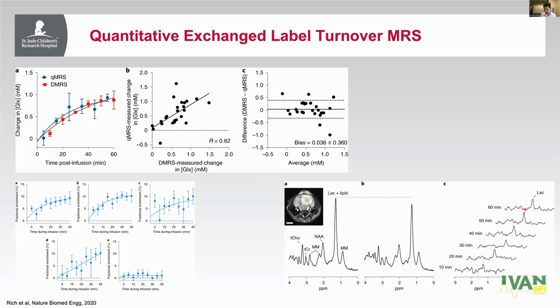But the problem with this technique is it's proton MR spectroscopy. And we all know proton MR spectroscopy is very sensitive to motion. So we cannot deal with the slightest of motion during the scans.